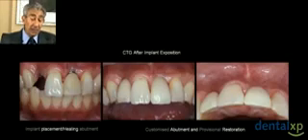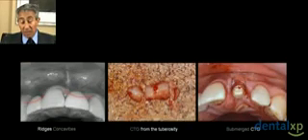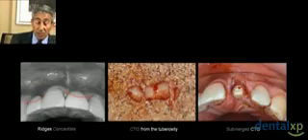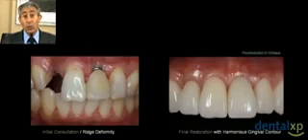It happened like here that unfortunately when we expose the case we did not have enough tissue, enough bone. The ridge is deformed, we have a depression, especially on the lateral, and some maybe exposition of the cover screw of the healing abutment. So here, when you draw a line, we can see definitely that we have two depressions, one on the lateral on the left, one on the central on the right.